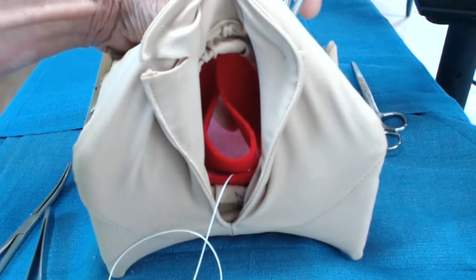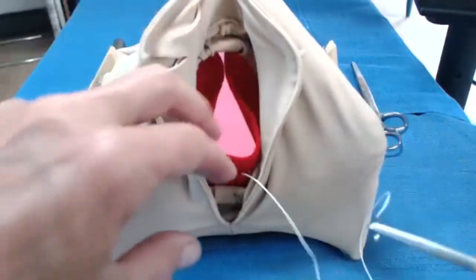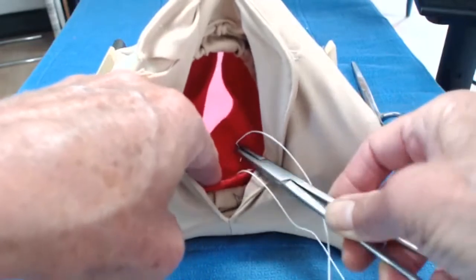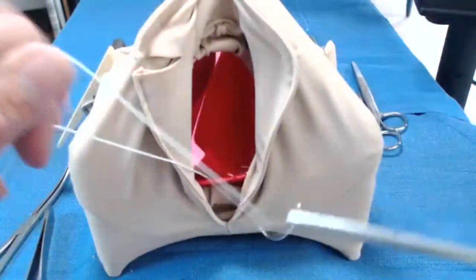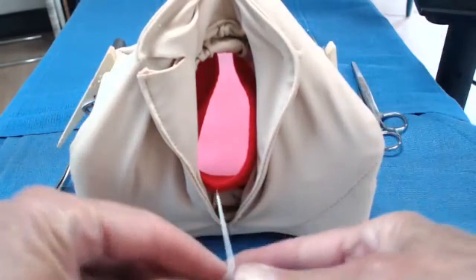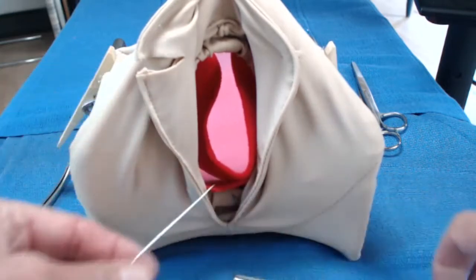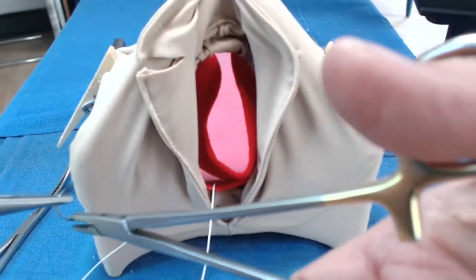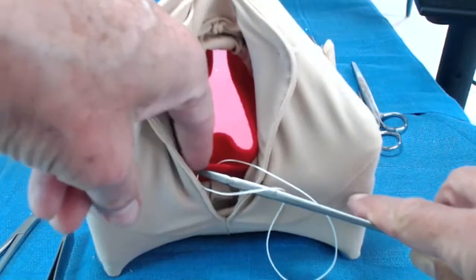These are the joys of simulation — it's not real tissue, so you can experiment with it; if it doesn't work out the way you like you can always just take it out and try it again. Now I'm going to place a second stitch, again going into the bulbocavernosus muscle and then bringing it across to the transverse perineal muscle, knitting them back together gently. You can see that this side is adhering and this side is still free. I may need to do two layers — one that's fairly deep depending on how deep the pocket goes, and then one that's more shallow.